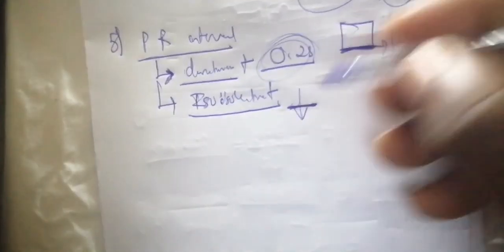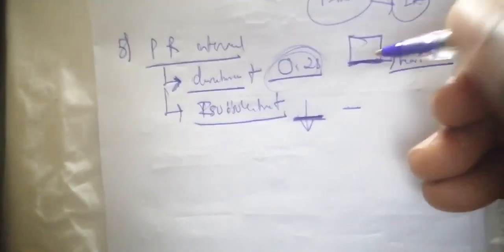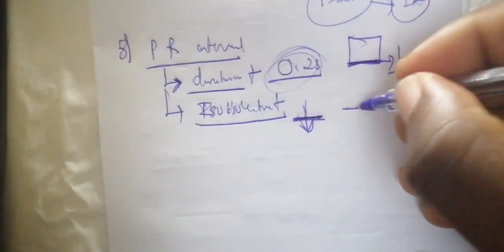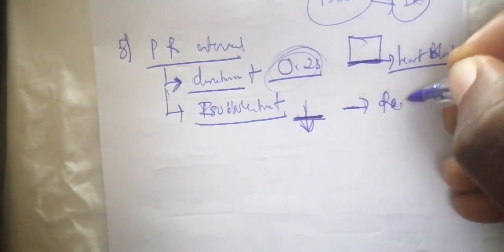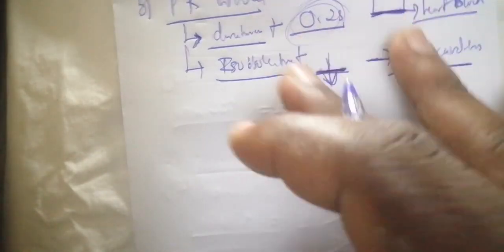And in a disease where you have a PR interval depression, where it is below the isoelectric point, in order for you to know the isoelectric point, you compare both the ST segment and the PR interval. Is it clear? So if you have a depression of the PR interval, it's going to correspond to the early stage of pericarditis. Is it clear? Early stage of pericarditis or stage 1 of pericarditis. So those are different pathologies that you have to visualize. Now, the next element after that is the QRS complex.